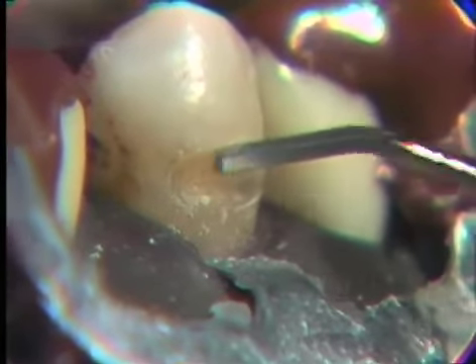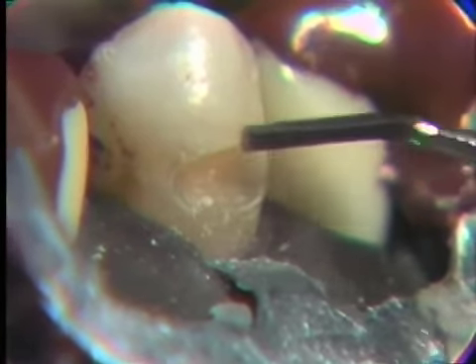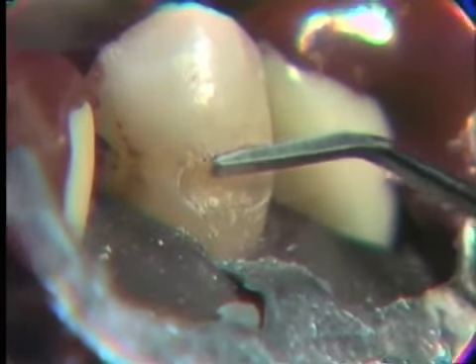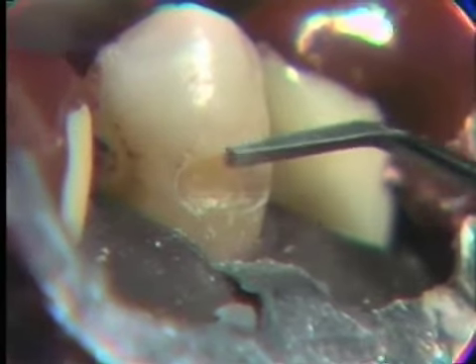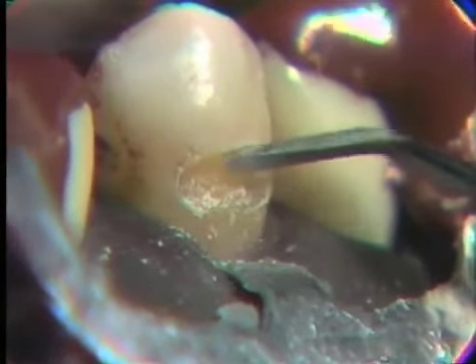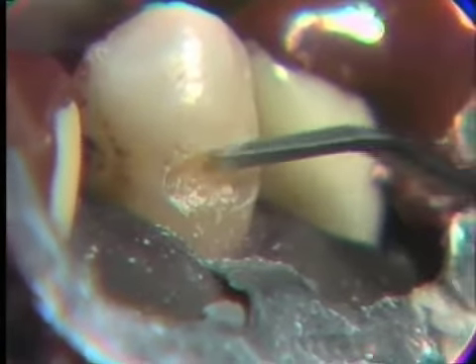I'm trying to keep my hands away from the TV camera here a bit. You may want to come up closer to the tooth and support on the arch that you're working on. Note the angle that this instrument is being applied to the tooth and the shavings that are coming off in there, smoothing up that margin.